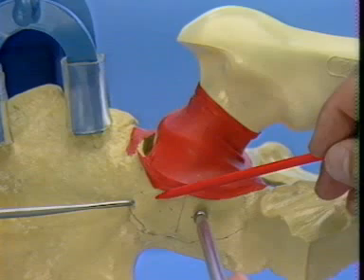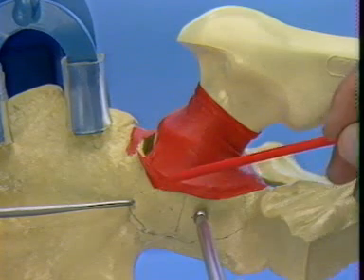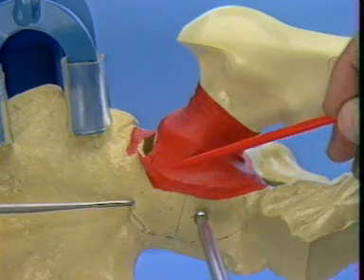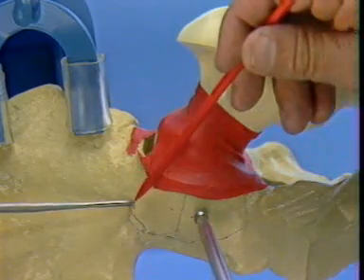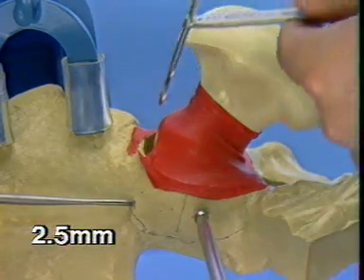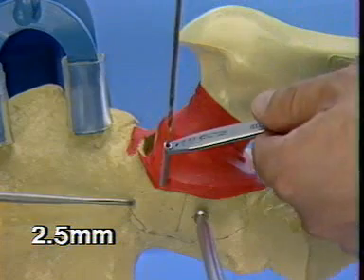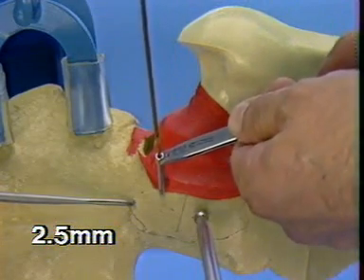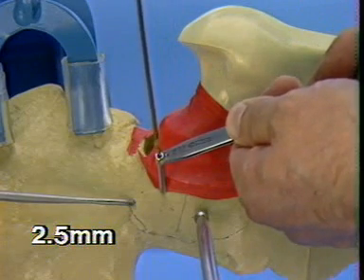A lag screw is placed into each fragment near the rim of the acetabulum. The screws must leave adequate room for the plate, which will span the fragments. With the patient in a lateral position, the 2.5 millimeter drill bit is directed vertically in order to avoid entering the joint.